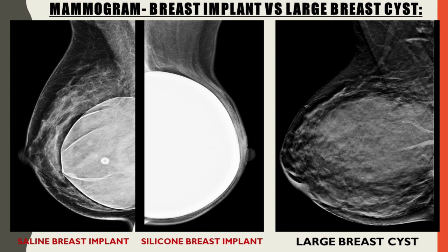Compared to a silicone implant, the silicone implant is bright white, much brighter than a cyst. When compared to a saline implant, the saline implant is more radiolucent than the silicone breast implants. It's translucent and you can see the valves and the folds through the implant. Compared to the large breast cyst, the saline implant has much more well-defined borders and is a more obvious structure in the breast.